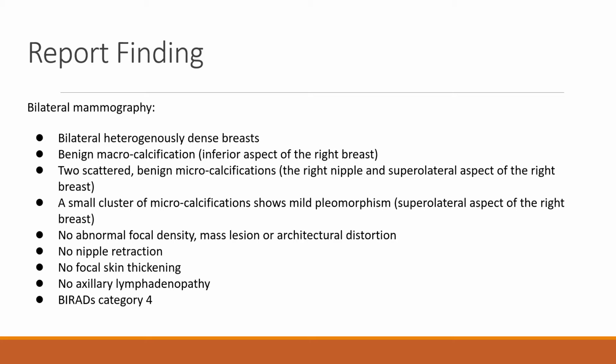Microcalcifications are usually not a result of cancer, but if they appear inside precancerous cells or early breast cancer, the microcalcification will be determined to be either benign, probably benign, or suspicious. In this case, it is a benign microcalcification. Benign calcifications are considered harmless. No further evaluation or treatment is needed.